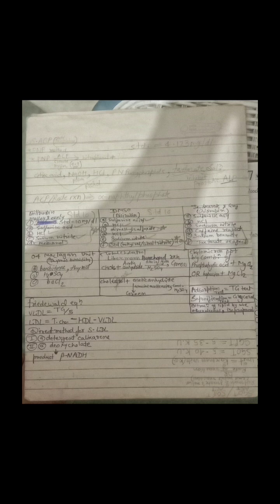Here the reagents are sulfanilic acid, HCl, sodium nitrite and methanol. Whereas in the DMSO method for bilirubin, the reagents used are sulfanilic acid, HCl, sodium nitrite, dimethyl sulfoxide and a standard, that is a stain.